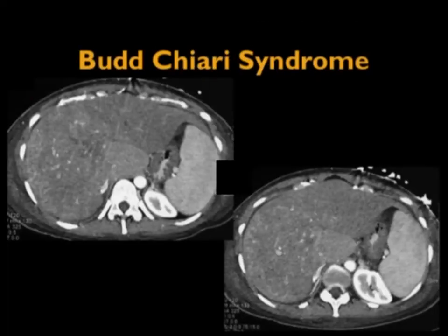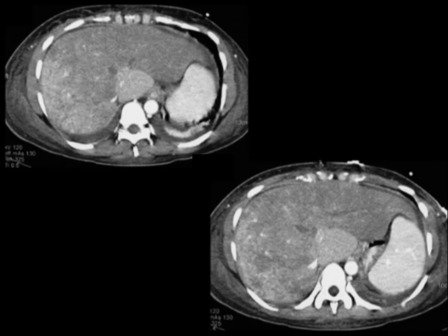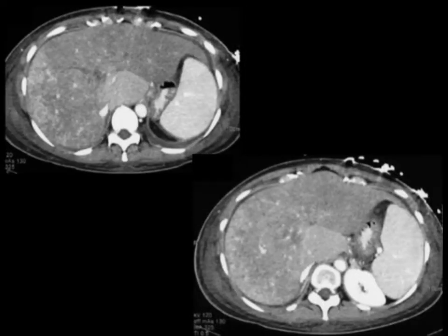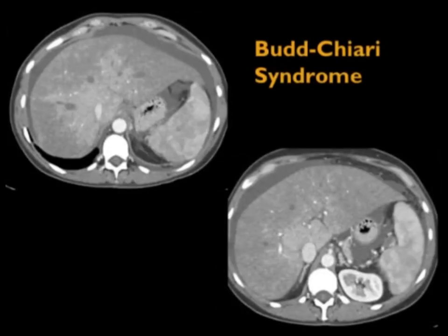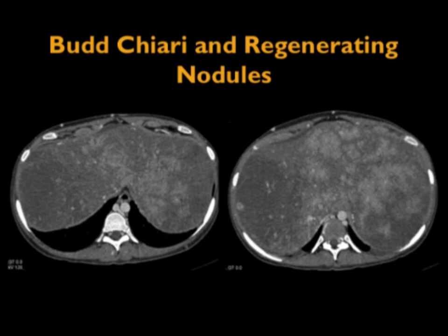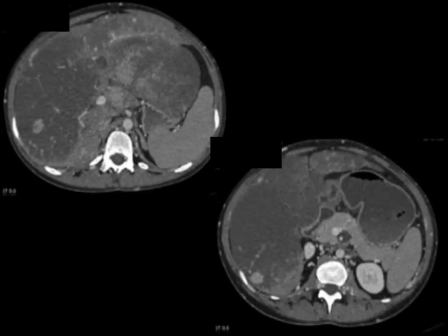Here's a beautiful example of Budd-Chiari: prominent enhancing caudate lobe, central increased density, peripheral decreased density. Going from arterial to venous phase, now the periphery is bright and the central is low density. You don't see the hepatic veins — a very nice example. And here are more images showing the flip-flop phenomenon and perfusion changes. Another case shows central bright enhancement with a mottled pattern, and this patient has multiple nodules — probably best seen on the venous phase acquisition.